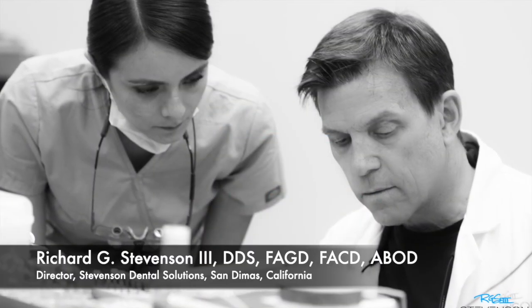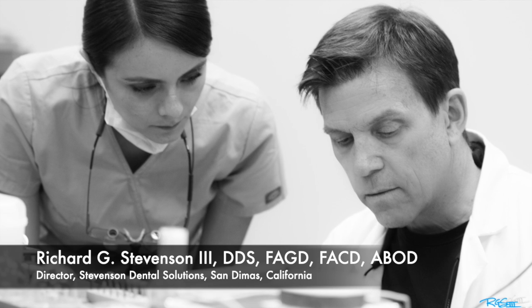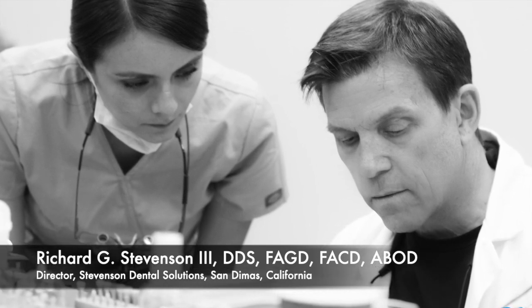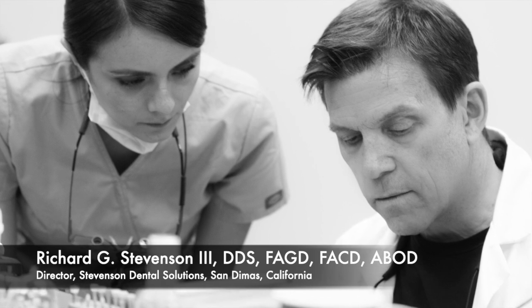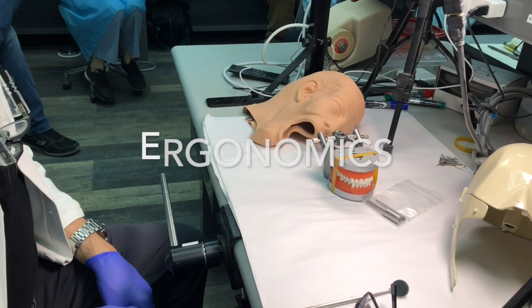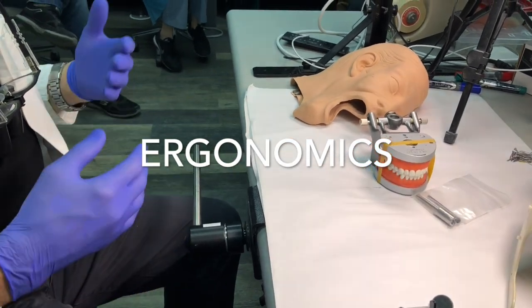Hi everybody, I'm Dr. Richard Stevenson, director of Stevenson Dental Solutions in San Dimas, California. Today I'm going to show you a brief excerpt from one of our sessions on ergonomics. Hope you enjoy this session.